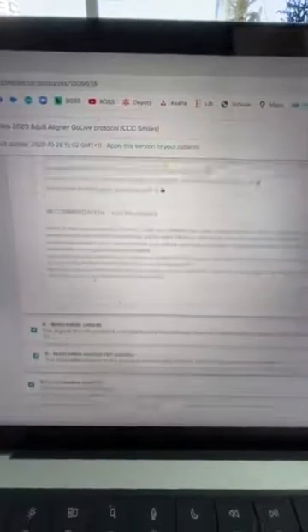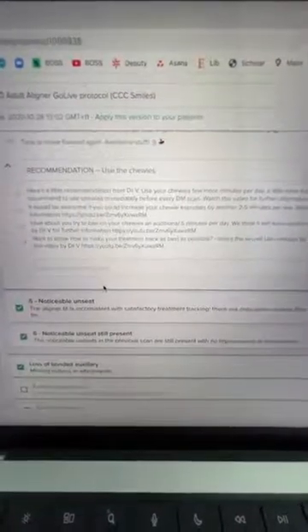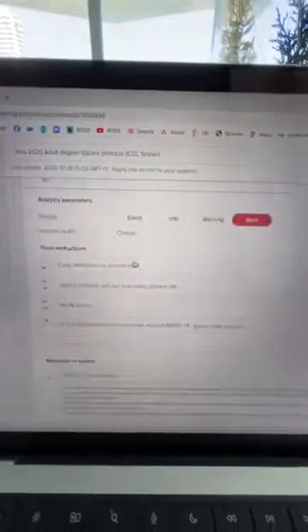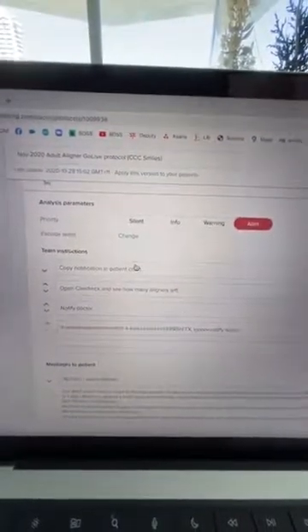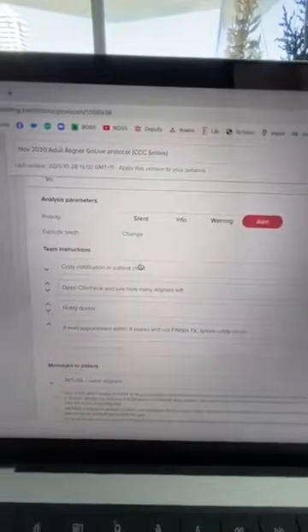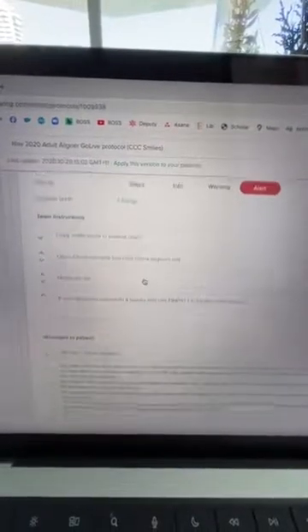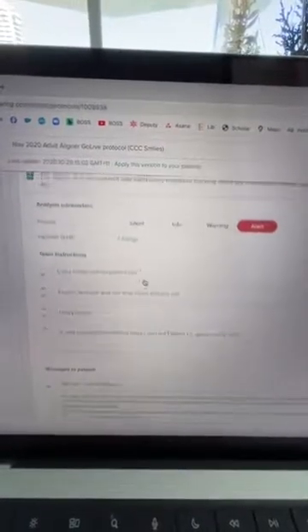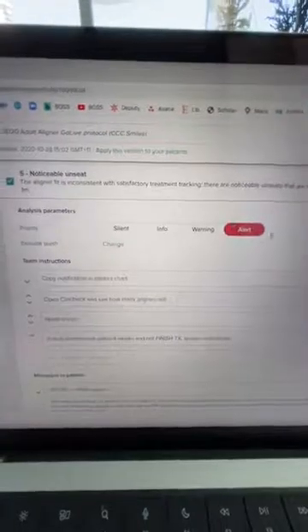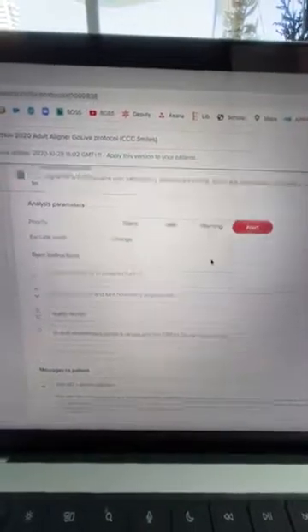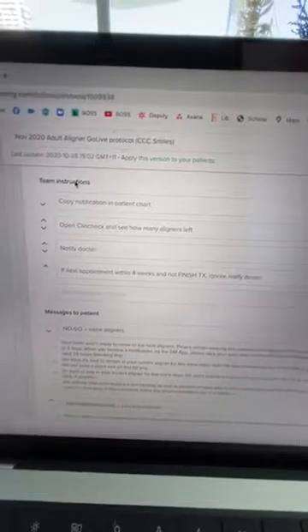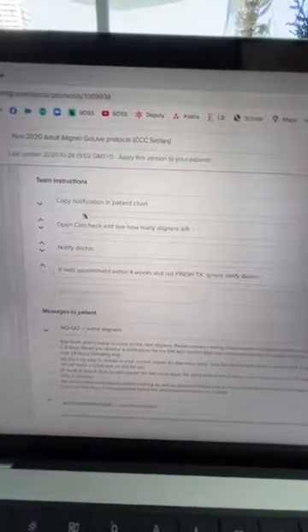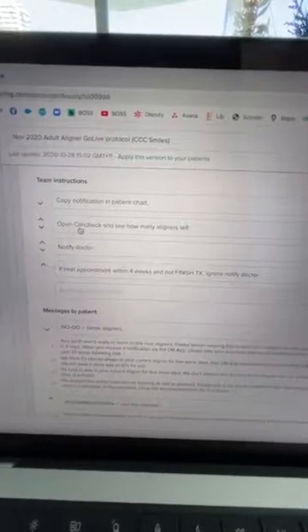If it's a slight unseat two times in a row, please tell my patient to change their aligners and give them a recommendation to use the chewies so the aligners can fit a little bit better. What if it's a noticeable unseat, meaning there's a very obvious gap between the tooth and the aligner? If there's a noticeable unseat I want to be alerted - there's a red alert here.